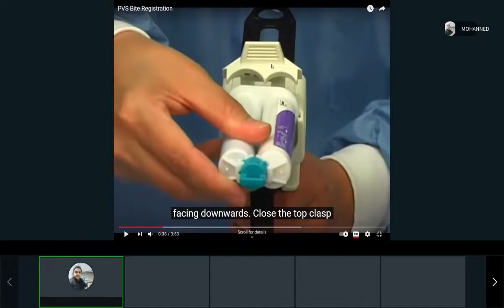It also comes in what they call putty, and I'll show you another video about it. But polyvinyl siloxane comes technically in about 3 forms. It can be in a cartridge, it can be in tubes that you mix by hand, and it can be a putty that you also mix by hand, but it's thicker. While alginate just comes in one form. It's powder, right? But let's take a look at what they're going to do.